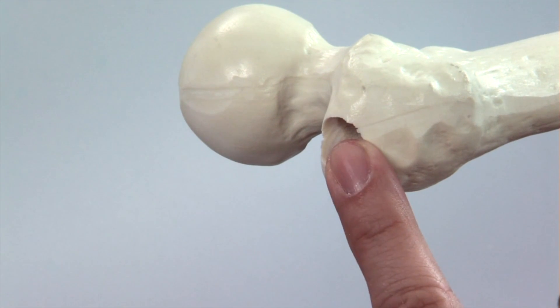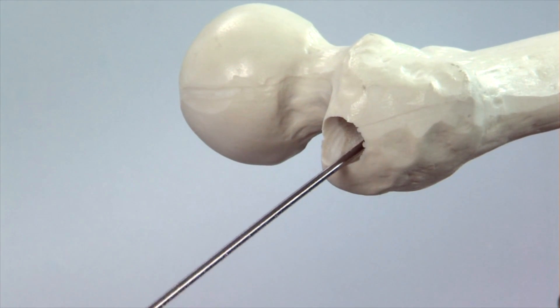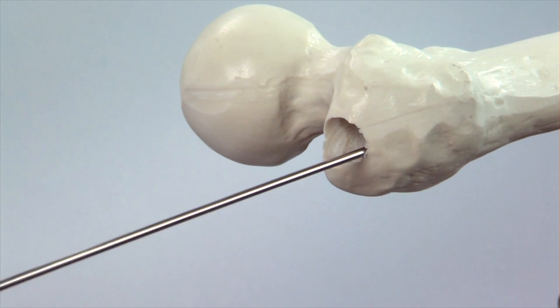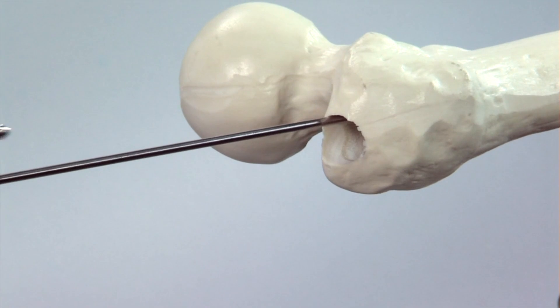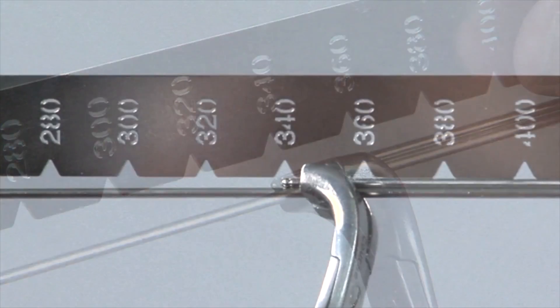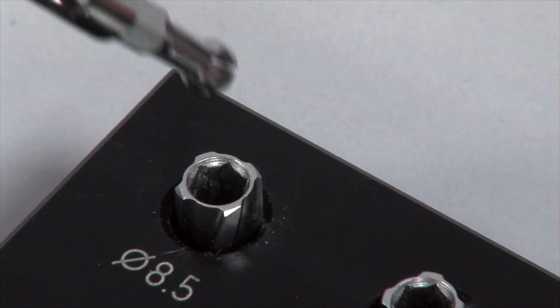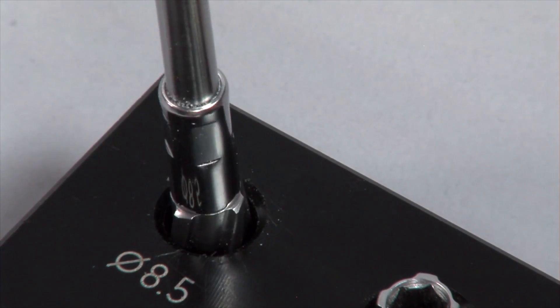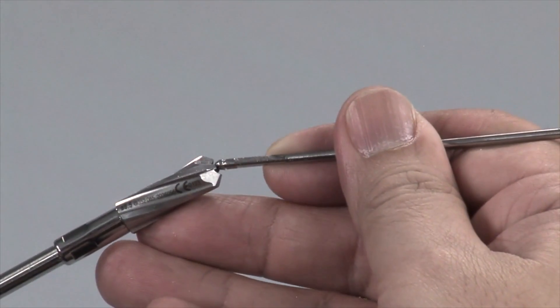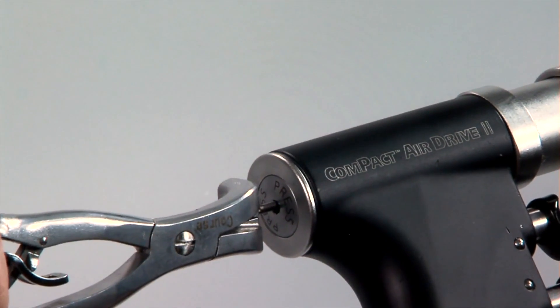The reaming rod with bull tip is inserted. The tip of the reaming rod should lie in the centre of the distal femoral condyle; this will prevent a valgus or varus deformity at the fracture zone. To determine the nail length, another reaming rod of the same length is placed alongside the first, and the excess is measured to give the nail length. In this exercise, the nail diameter is 9mm, so reamer heads from 8.5mm to 10mm will be used in 0.5mm increments. The reamer head is mounted on the flexible shaft and slid over the reaming rod. The holding forceps is mounted on the end of the reaming rod to prevent inadvertent extraction of the reaming rod.